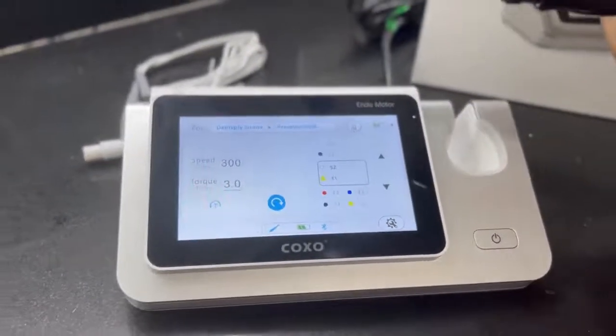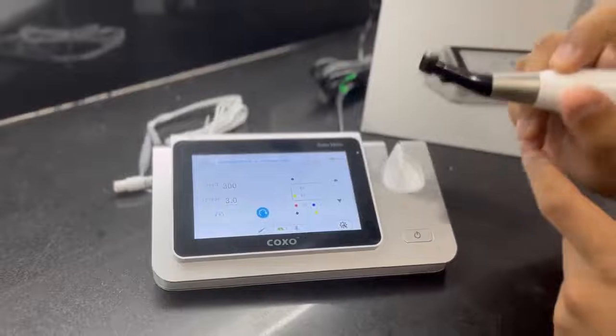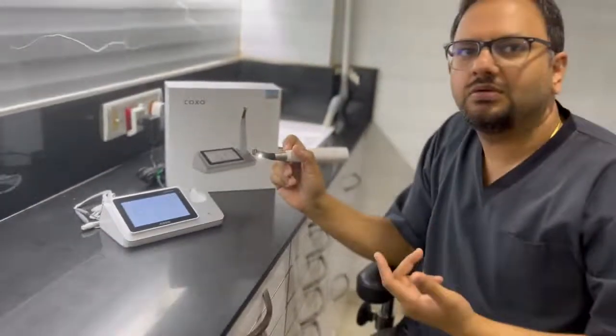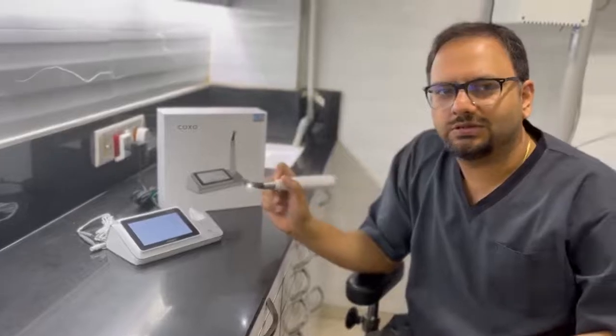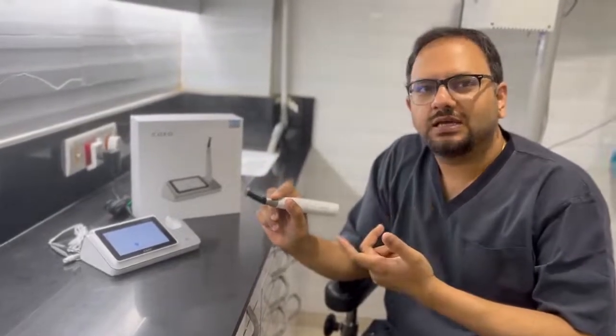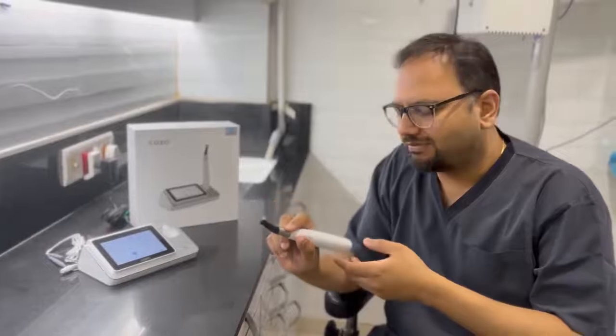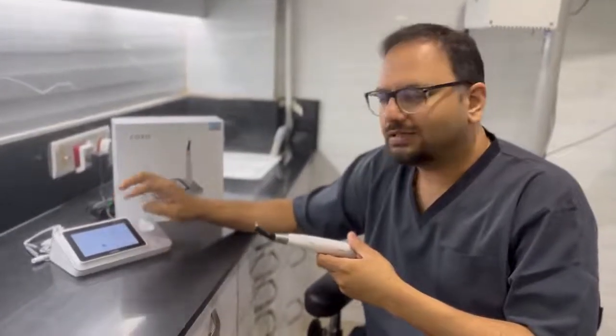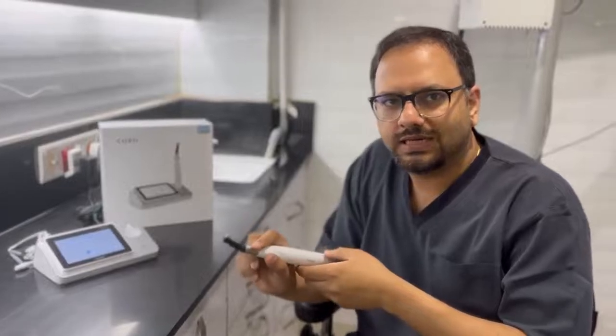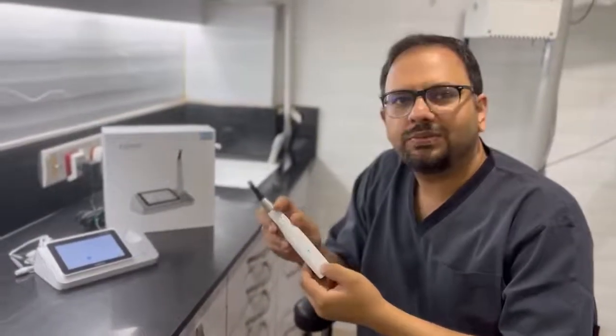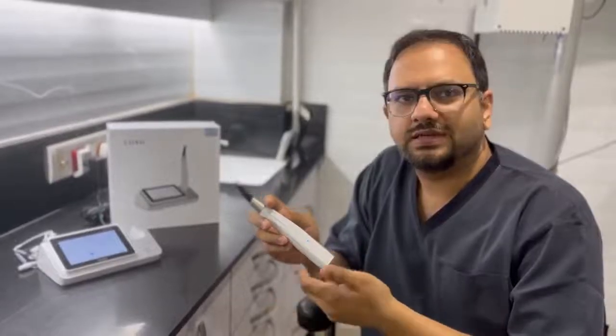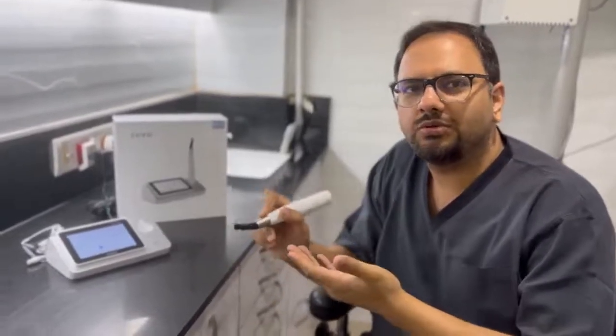Once I choose the particular setting and I start the unit, it automatically starts rotating or reciprocating as per the function of the model. Now if I need to change this to the next file, I have an option of either going back to the base model and increasing or decreasing the setting on the file, or I can simply press the single button that is over here to just switch to the next file. So I don't need to go back to the module each and every time.